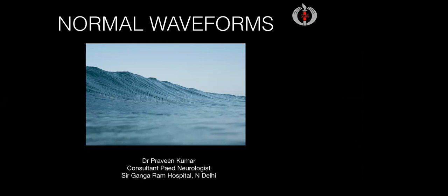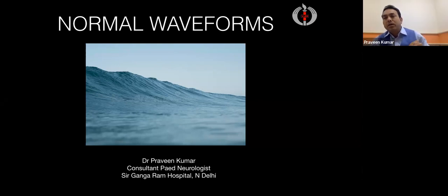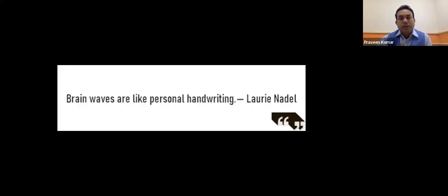But before we start picking up the abnormalities, before we start picking up the abnormal waves, it's very wise to know what is normal in an EEG graph. I mean, as for any other modality, because once you know the normal, it becomes easier to pick up what is different from the normal and may be abnormal.